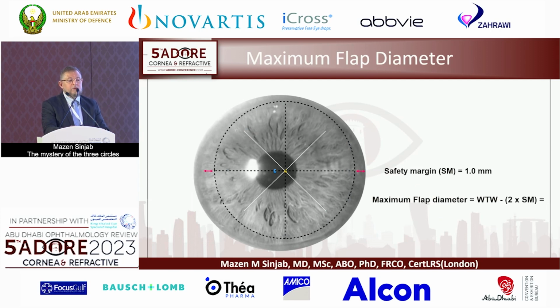Then we have to determine or to measure the maximum flap diameter, okay? The allowed maximum flap diameter, because we have to keep at least 1 millimeter safety margin away from the limbus. So maximum flap diameter is white to white minus 2 millimeter. This is the maximum flap. So if, for example, the white to white is 11, then the maximum should be 9 flap diameter, okay? And if it is 12.5, so the maximum can be 10.5.